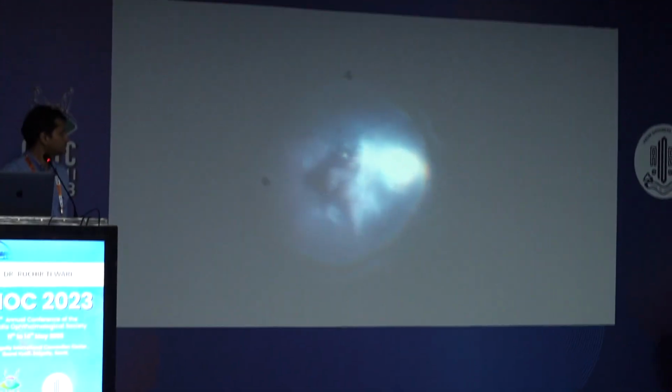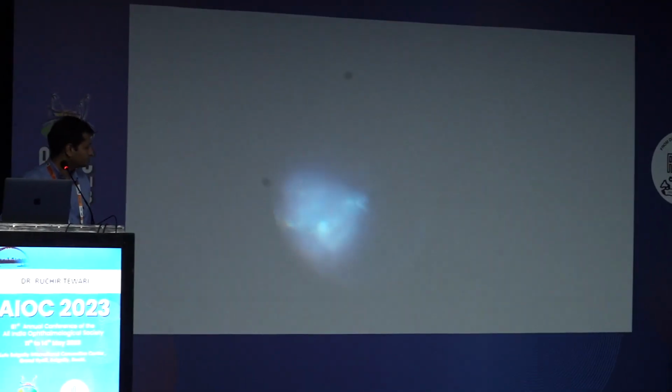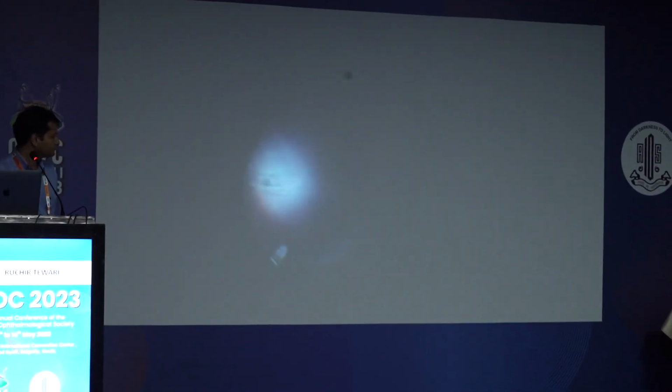Remove the oil on table, we'll just depress all around and check everything. There's no obviously untreated break or doubtful areas. If it is there, you do laser and reschedule as well. Like if there is a suspected untreated break or new break, or if there is hypotony, because many times you cannot check IOP also.